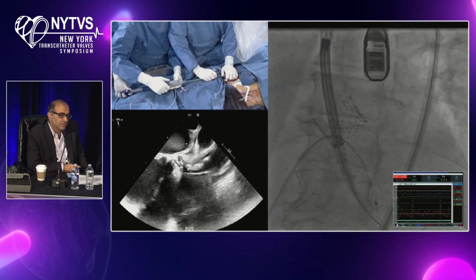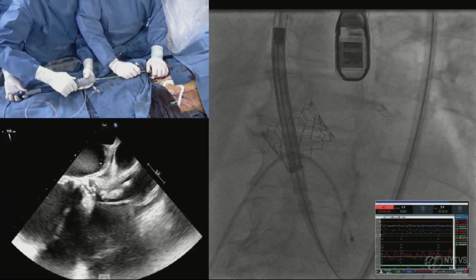You want to start here? You want to start higher? Start here. Yeah. So we're diving.